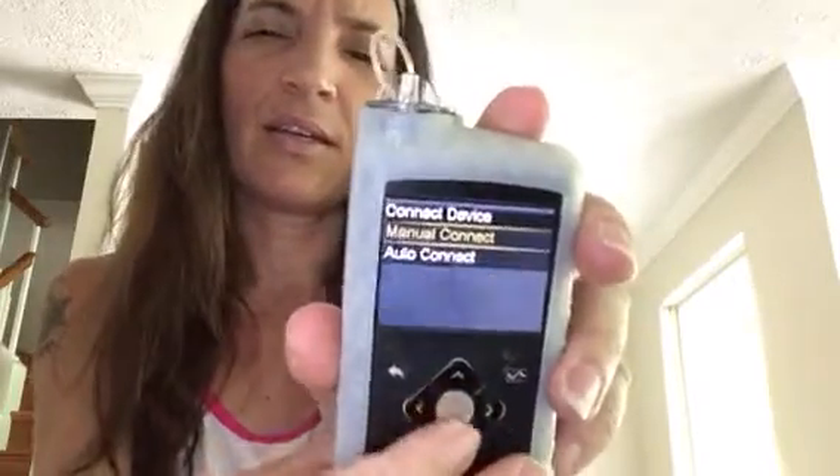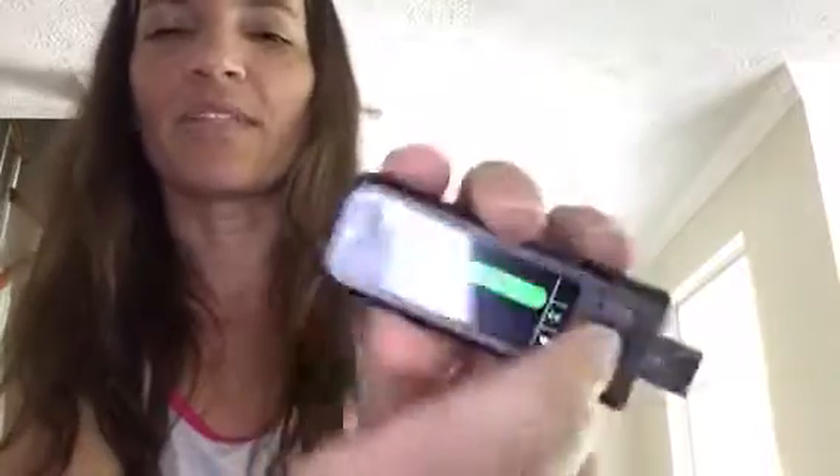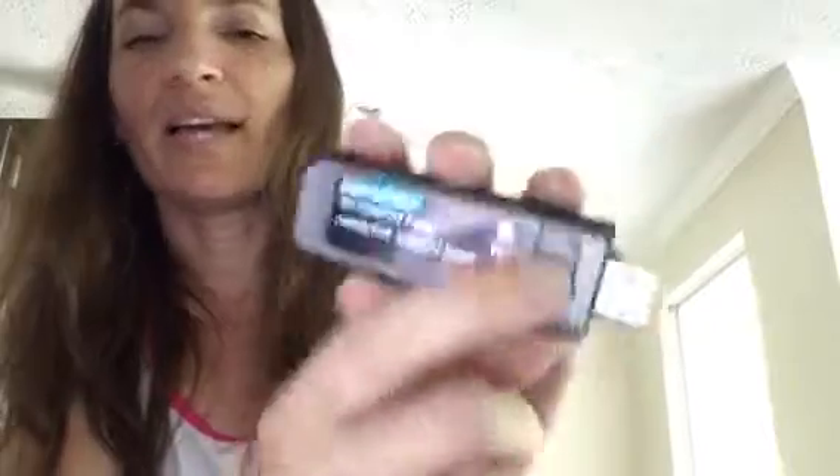Now everything has been cleared out. The next thing I'm going to do — and they told me to start with my meter — is connect my meter again. You need to have your transmitter on the charger. I'm gonna go back to Connect Device, go to Auto Connect, but I'll wait one minute because the meter will tell me to do the same thing. So I'm going back to my meter, going to Pump Options.